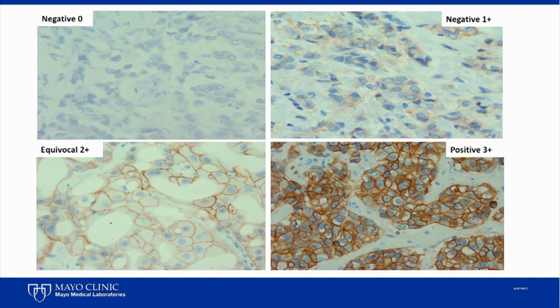Following up on correspondence published in the Journal of Clinical Oncology in April 2015, the panel has redefined 2+ staining as follows: weak to moderate complete membrane staining observed in greater than 10% of tumor cells. This change to the definition of 2+ equivocal staining was primarily made because the descriptors incomplete and circumferential used in the 2013 definition were thought to be contradictory.